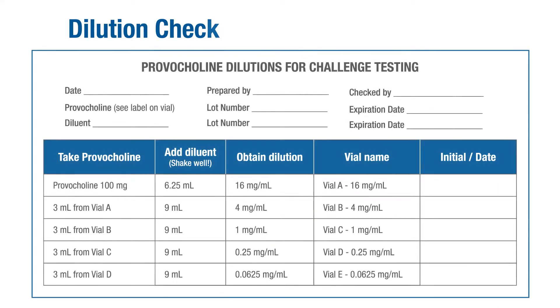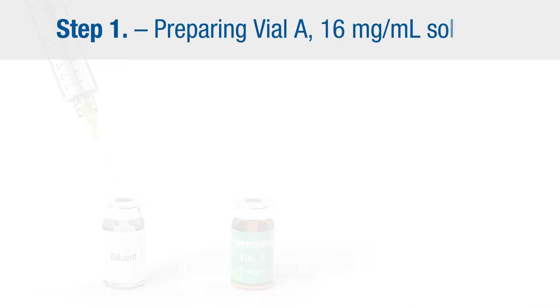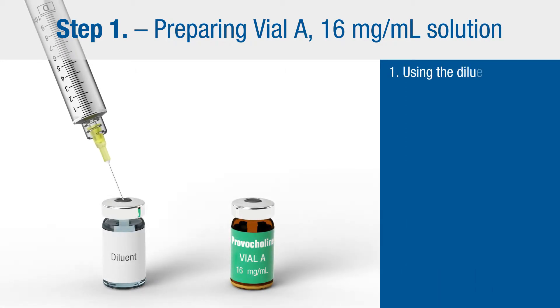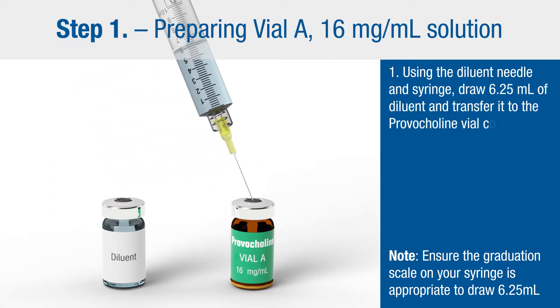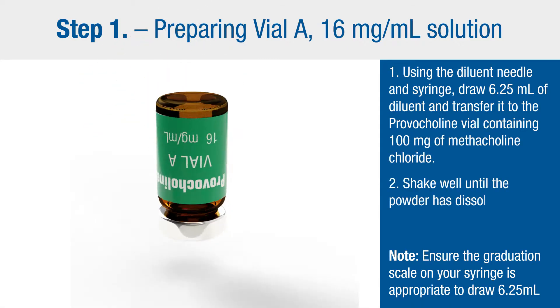We also recommend using a dilution check sheet and control record. This example is available for download on the Provocholine website. Step one: preparing vial A, 16 milligram per milliliter solution. Using the diluent needle and syringe, draw 6.25 milliliters of diluent and transfer it to the Provocholine vial containing 100 milligrams of methacholine chloride. Shake well until the powder has dissolved.